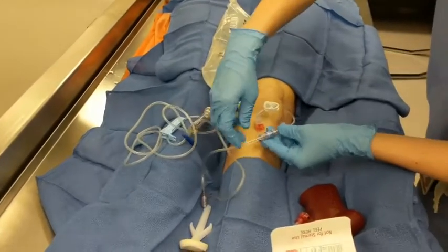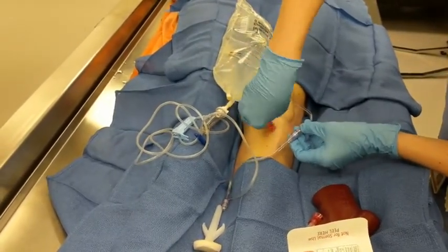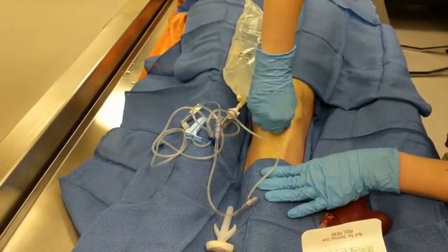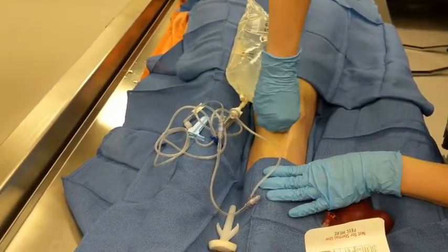In order to remove an intraosseous line, it should first be disconnected from IV fluids. A twisting upward motion should then be repeated until the line is freed from the inner cortex and skin.